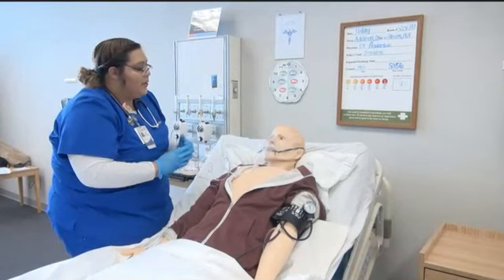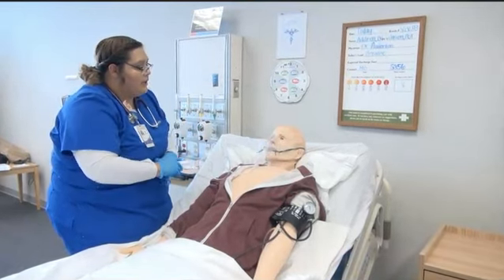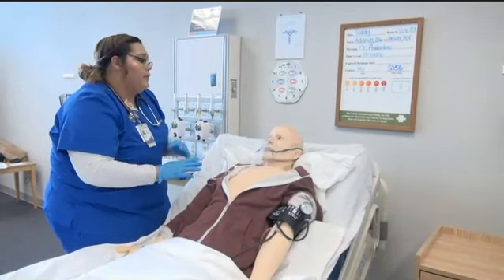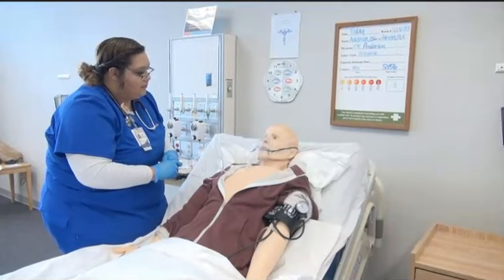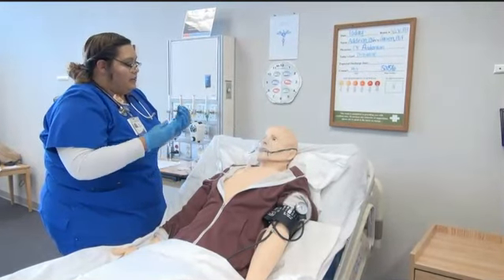So on this breath, I want you to take a deep breath in, and we're going to count to 10. That way we can get the medication going all the way down to your lungs, okay? Notice she explained why you must do a 10-second hold.